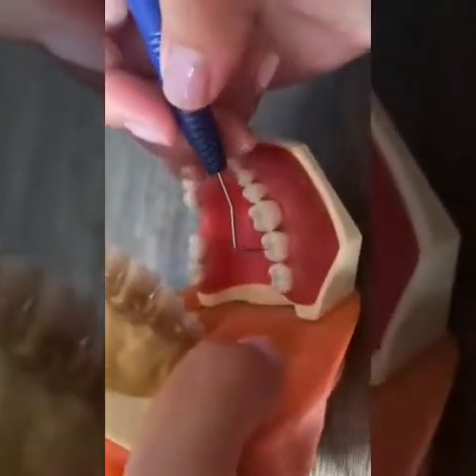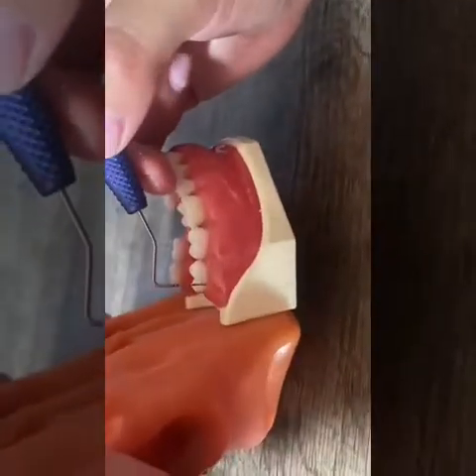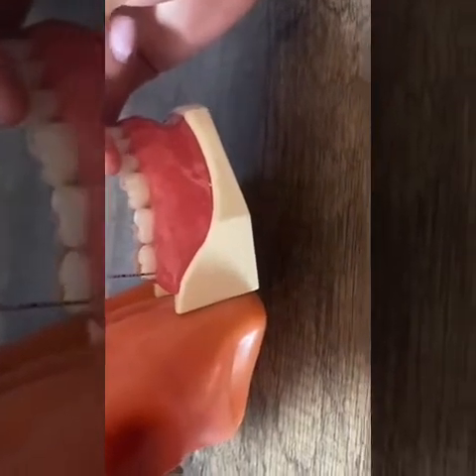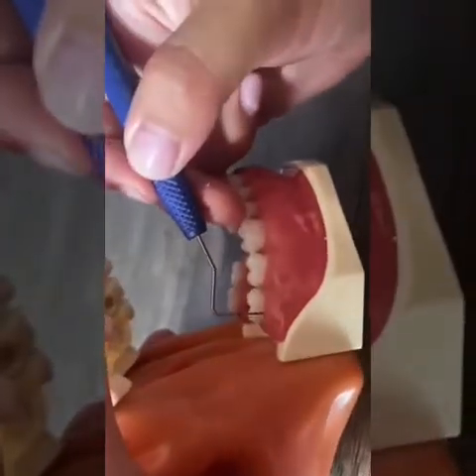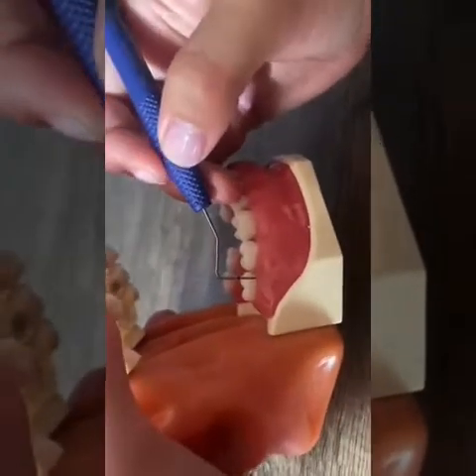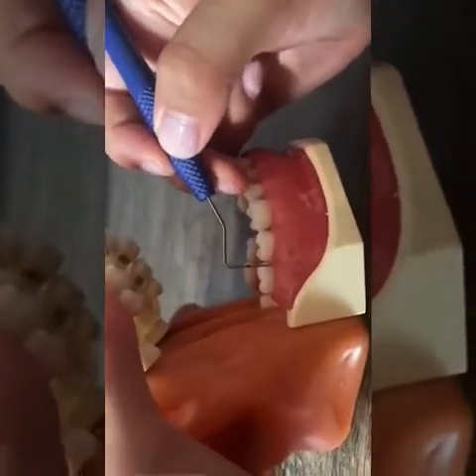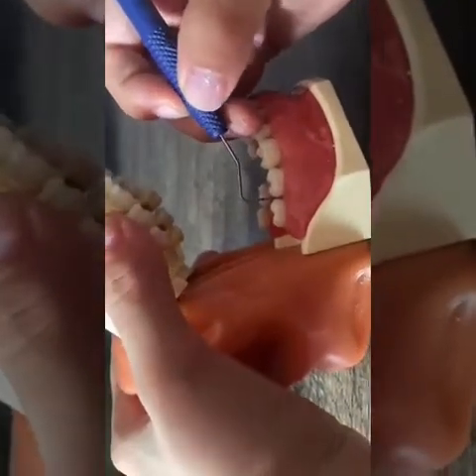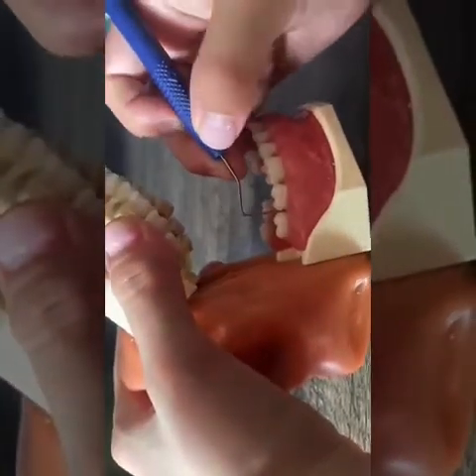When you record a number on each section, you record the deepest measurement. Say you start right here on the distal line angle, and then you walk the instrument back and you record the deepest depth. Then you start again at the distal line angle, walk the instrument all along the facial, stop here at the mesial line angle, and record the deepest depth. Then you start again here, walk the instrument, and stop right here at the col space in the interproximal area and record the deepest depth right there. So that's 3.